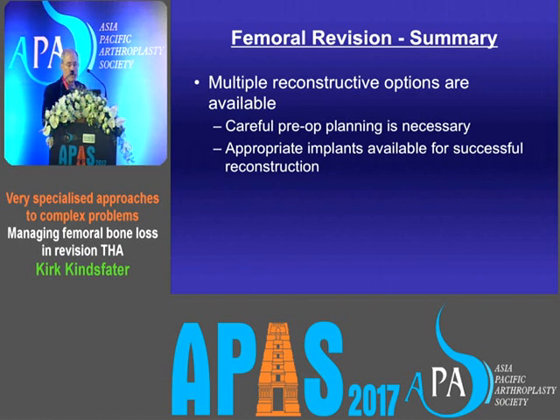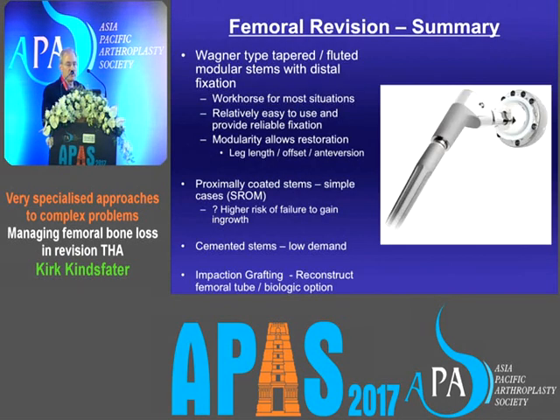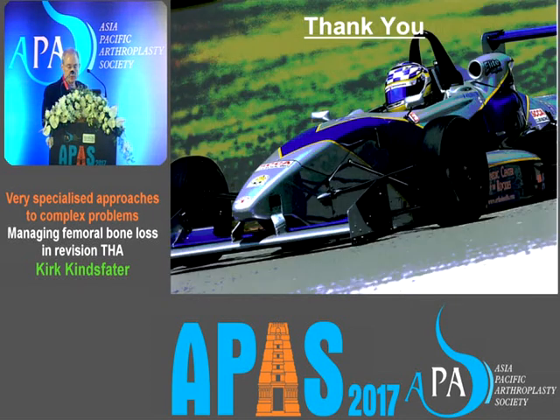You need careful pre-op planning. Appropriate implants need to be available. I think the Wagner type stem is really the workhorse now for most of these situations. It's easy to use. It provides reliable fixation. And now that we have the modular stem instead of the one-piece stems we used to have that were a bit difficult, we can now adjust leg length, offset, and anteversion.